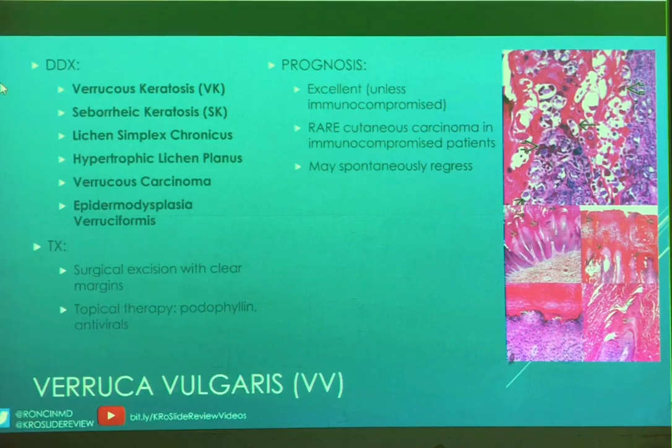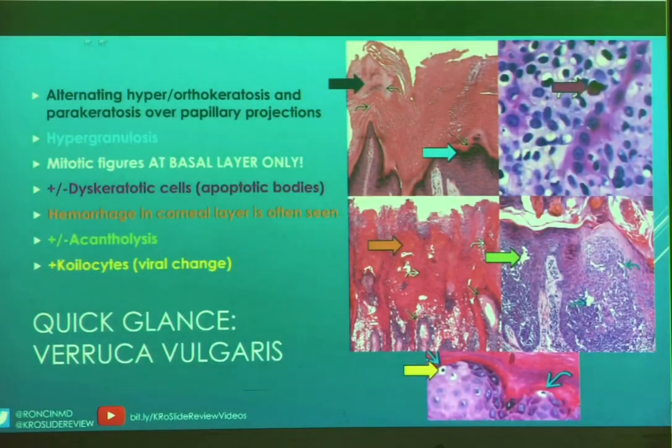So, verruca vulgaris, the common wart. I forgot I did these for this lecture. In this lecture, we tried doing something a little different. I took the main points for as many of these entities as I could and tried to put together a little quick cheat sheet. So the colors correspond with the arrows to show you the different features that you can look at.